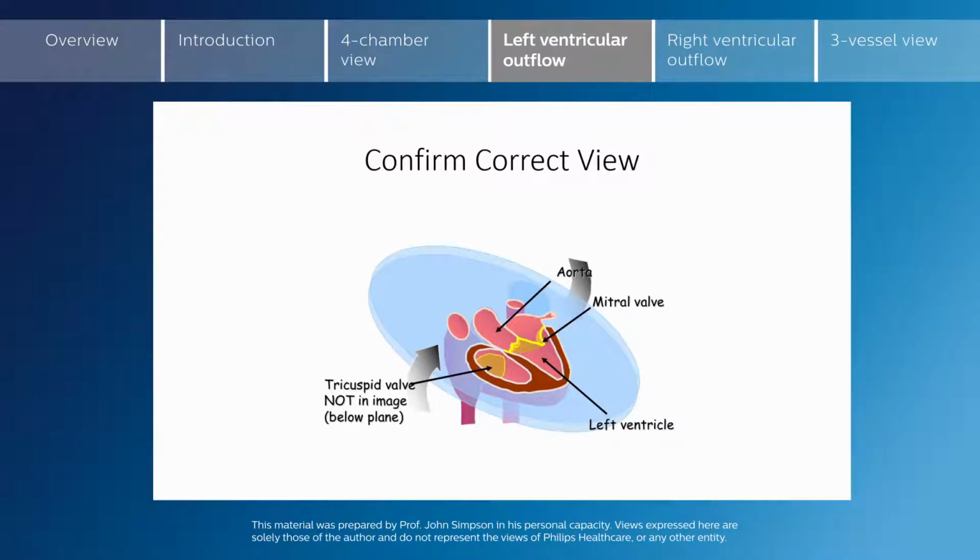What we would like to see is the left ventricle connecting to the aorta, which heads, as we see here, superiorly and to the right towards his right shoulder. We can also see that we're now beginning to move above the level of the right atrium and starting to cut the superior vena cava in transverse section.